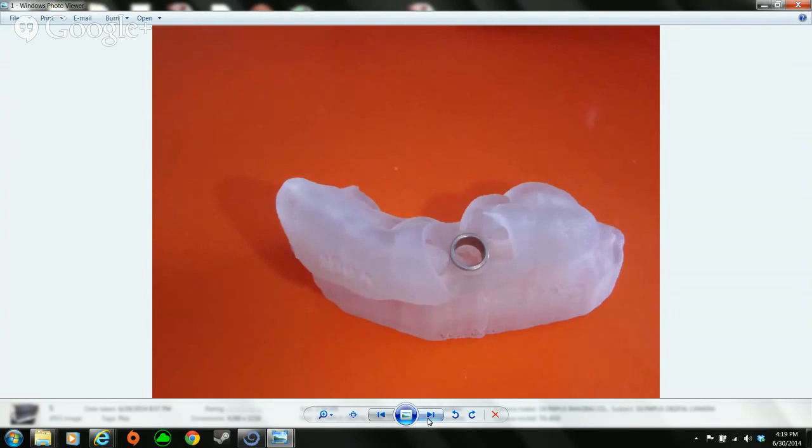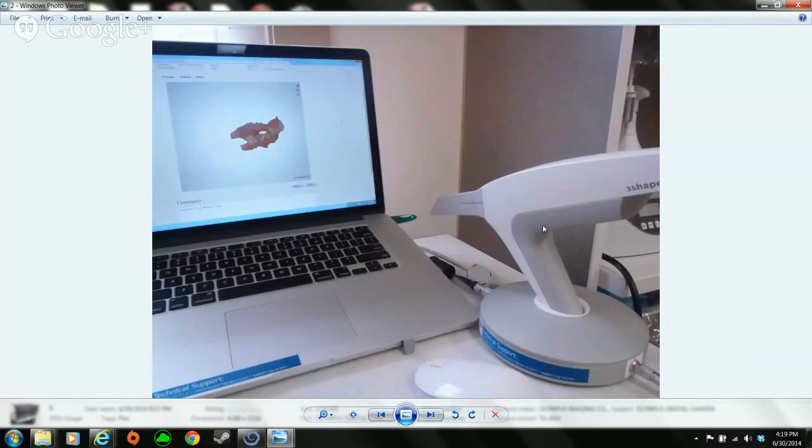And that's it. This is our scanner that we use. And I'm sorry that was short, but this is very simple, so it goes pretty quickly. There's not a lot to talk about. So if you have any questions, I'm open to questions.